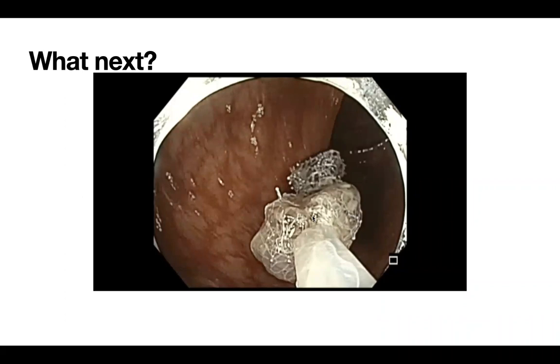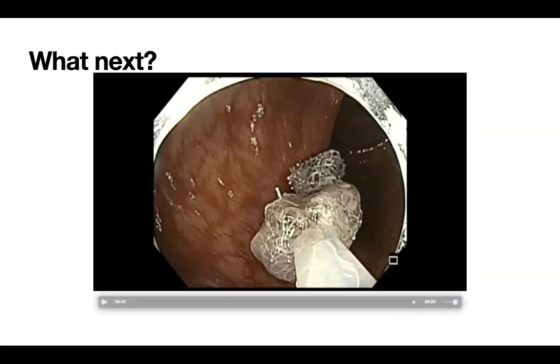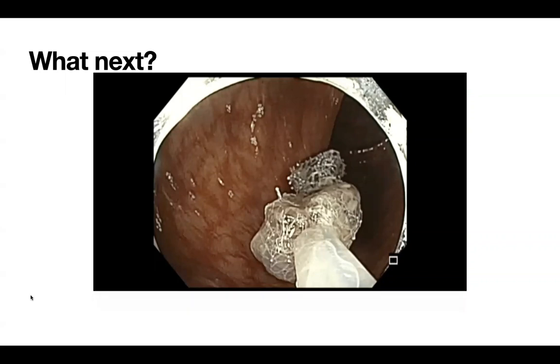I think you do have a point, is there a need for putting a tattoo? I very much agree. This is practice dependent. It can vary, but in our experience, these would be at least three criteria for the indications for placing a tattoo in this case.